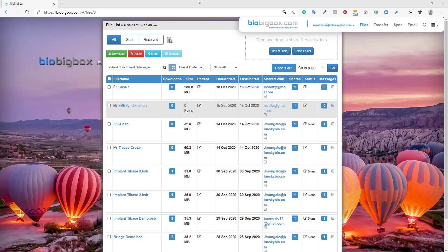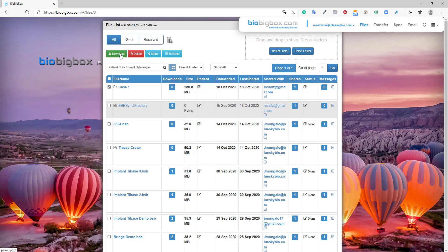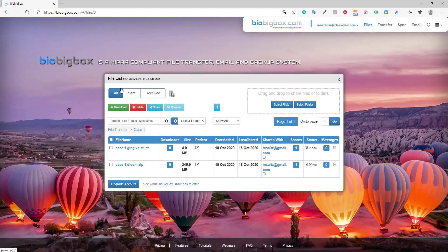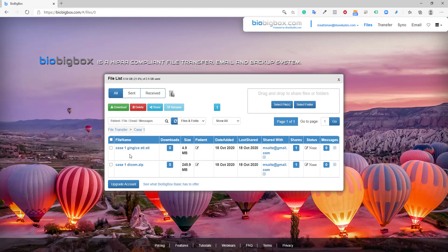Now we've switched over and we're looking at the bio big box account of msaltzman at blueskybio.com, the recipient of the case one folder. As I mentioned earlier, the recipient receives an email notifying them that there are new files or folders. They could directly from the email either download or click view in bio big box, which will open up this view. So the recipient can now go ahead and click on the folder, click the download button if they like to download the entire folder, or they could click into the folder and select a relevant file to download. And then they could go ahead and treatment plan the case, deal with the files however they want to deal with the files.